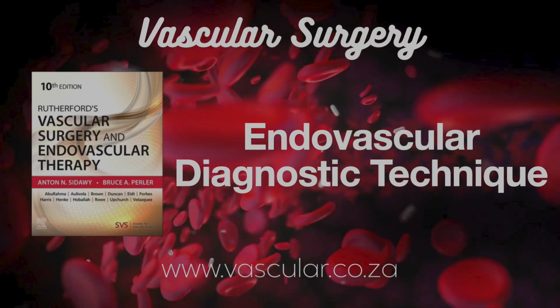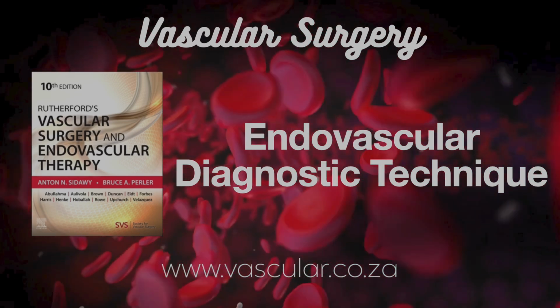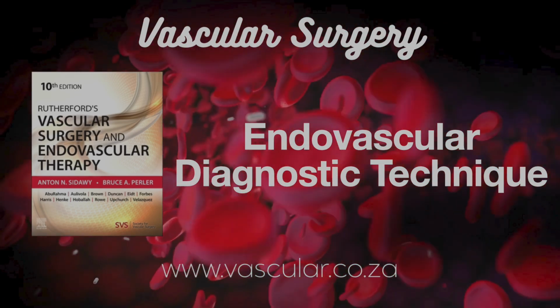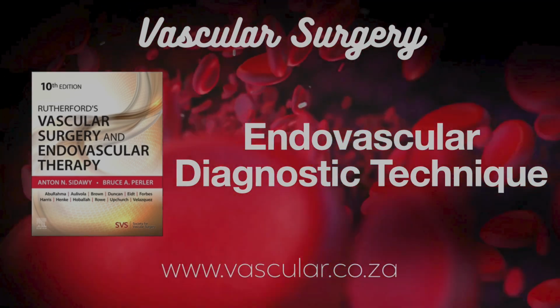All right, we've seen how versatile these techniques are, but things can go wrong. Let's talk complications. Access site issues seem common. They are definitely among the most frequent complications. Things like hematomas, the access vessel clotting off, thrombosis, bleeding requiring treatment, forming an AV fistula, or a pseudoaneurysm.